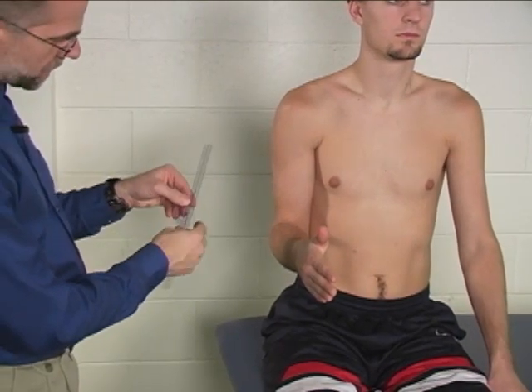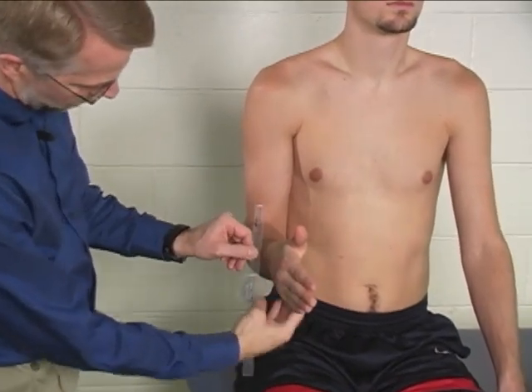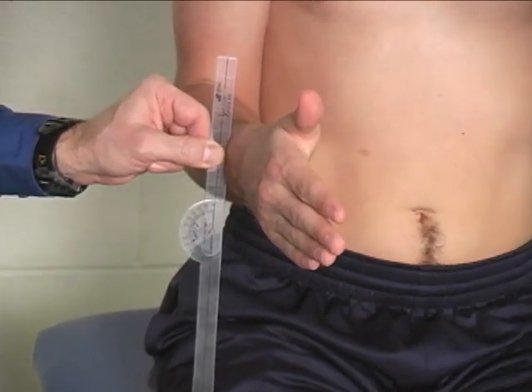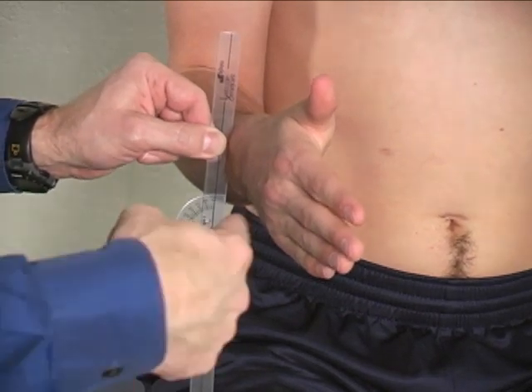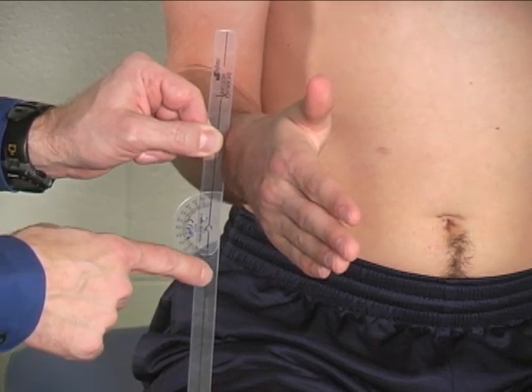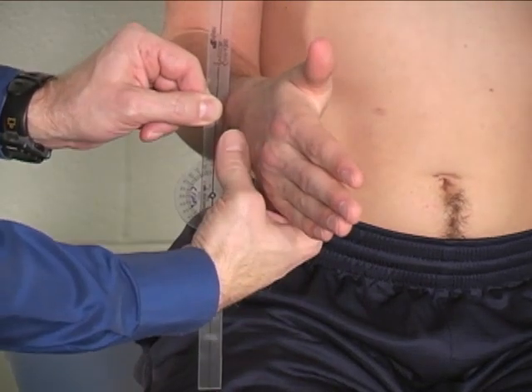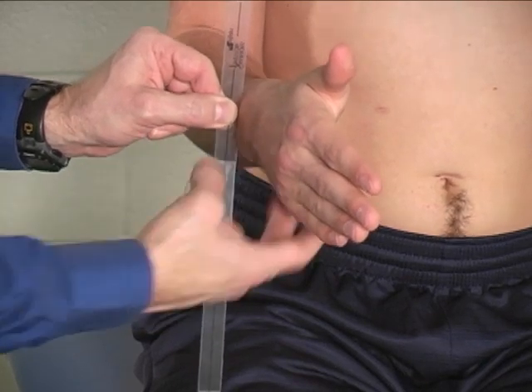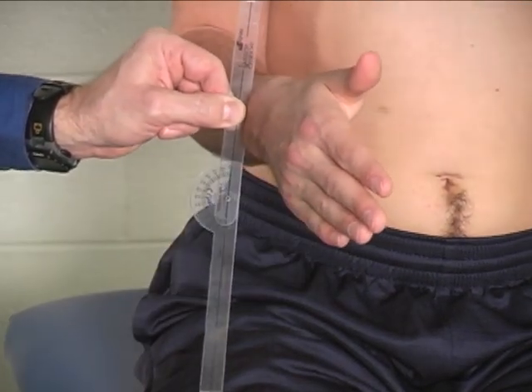The goniometer is placed on its edge so that the edge of the goniometer is placed on the dorsal-distal forearm, just proximal to the ulnar head. The axis of the goniometer is in line with the long axis of the forearm. The stationary arm is placed vertical and the moving arm is pressed into the dorsum of the forearm so that it seats across both the radius and the ulna.